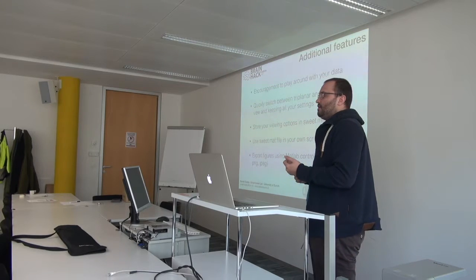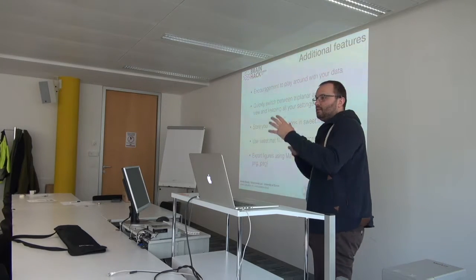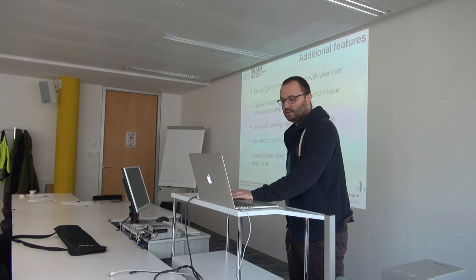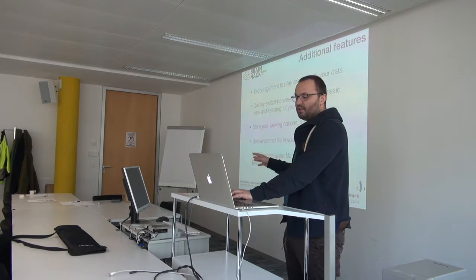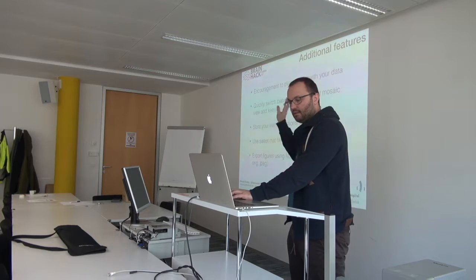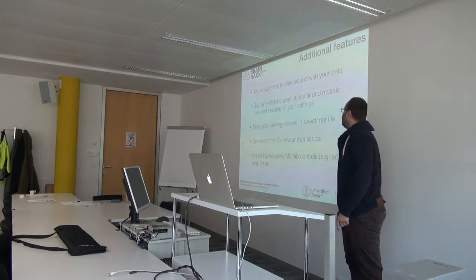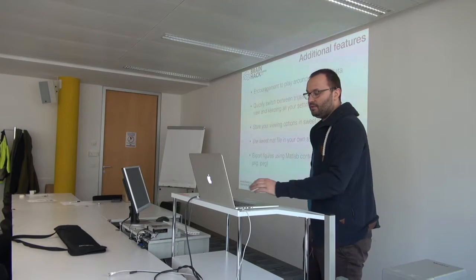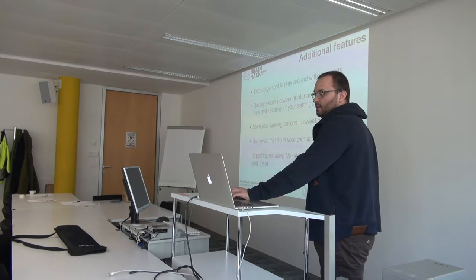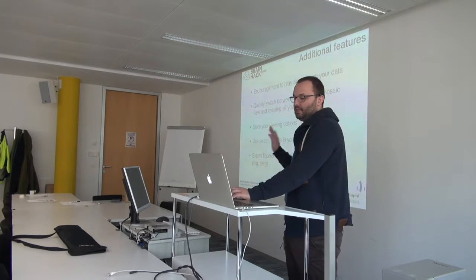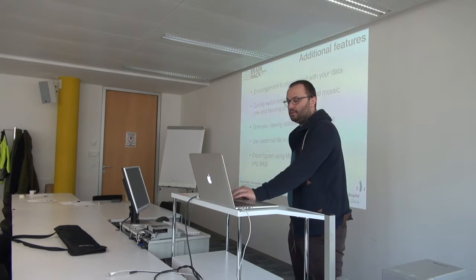You have a great way of exploring your data in a new way — it can help you fix problems with anatomical masks and zoom into what you're interested in. You can quickly switch between triplanar and mosaic view, which is quite tedious in SPM. You can store all your viewing options within a mat file — a SweetView mat file — which is a regular MATLAB structure you can also work with in scripts. You can export figures using the normal MATLAB export function: PDF, PNG, JPEG. All text is vector graphic so you can easily manipulate it afterwards.